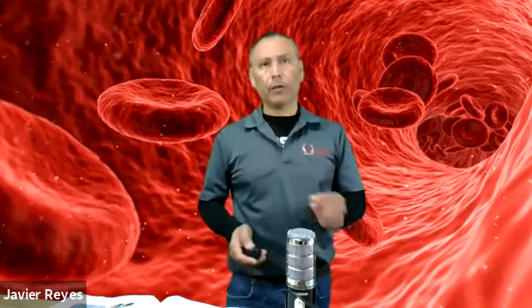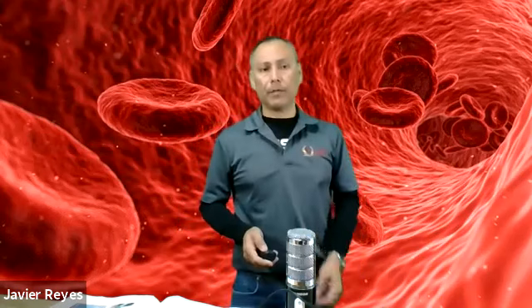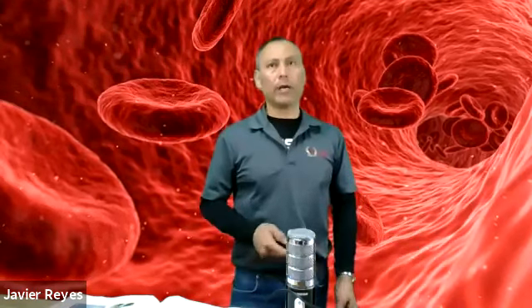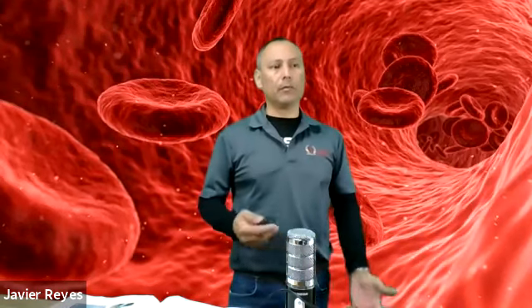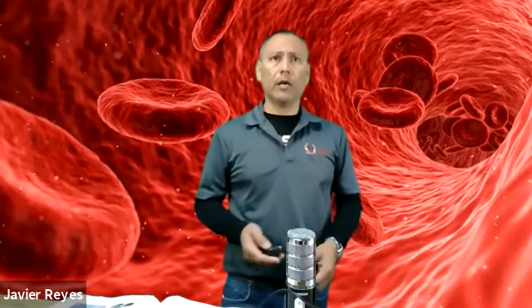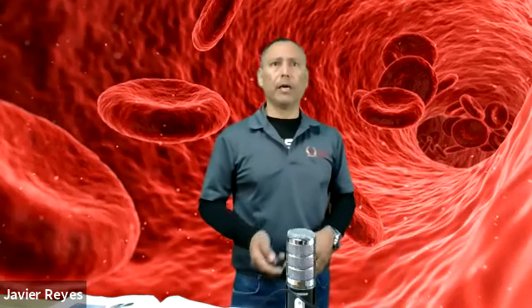Check the site after you're done. Make sure you always go back and check the site, make sure they're not bleeding, and apply your bandages. Once, if the patient is doing okay, you're going to be assisting them to getting off the chair and assist them back to their lobby or wherever the patient may be at.